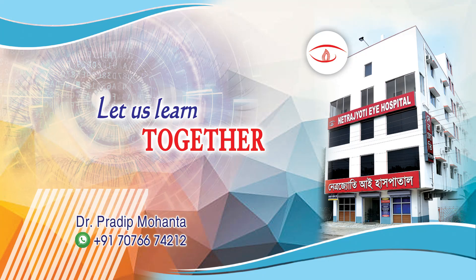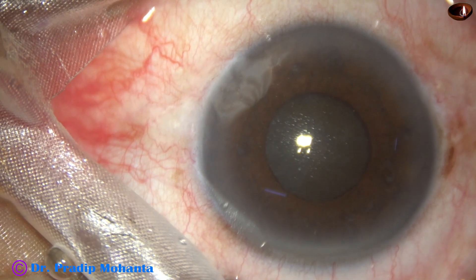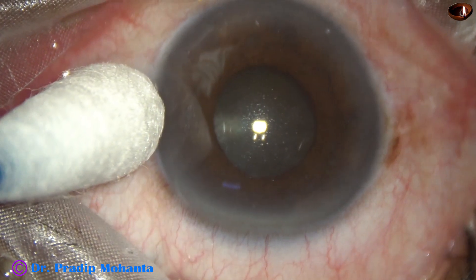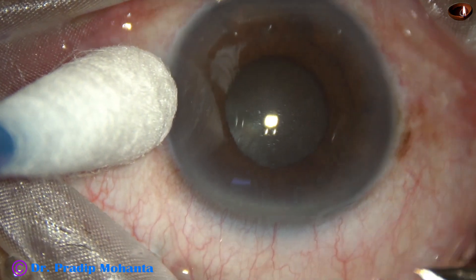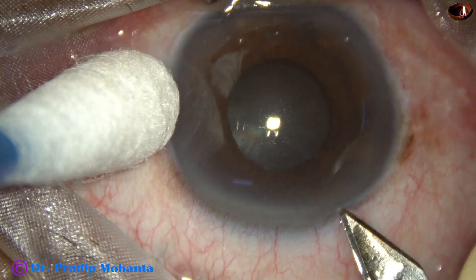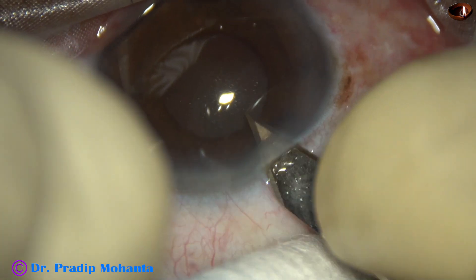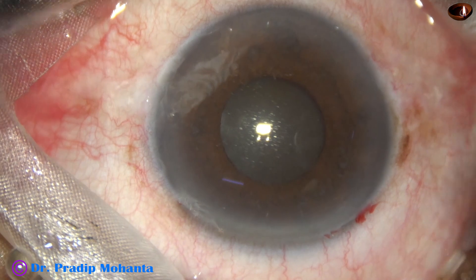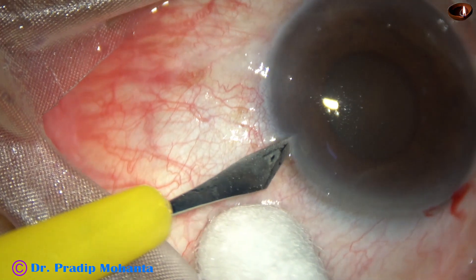Dear colleagues, welcome to my workplace at Ranakh Heart, West Bengal, India. This surgery has several challenges: hard cataract with nuclear sclerosis grade 5, small pupil, and floppy iris. The patient is an 85-year-old man who takes Tamsulosin for benign prostatic hyperplasia and has heart disease with associated medications — a lot of comorbidities.